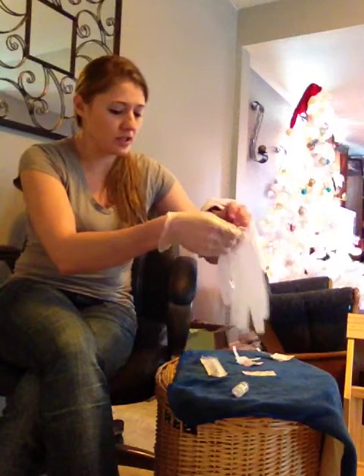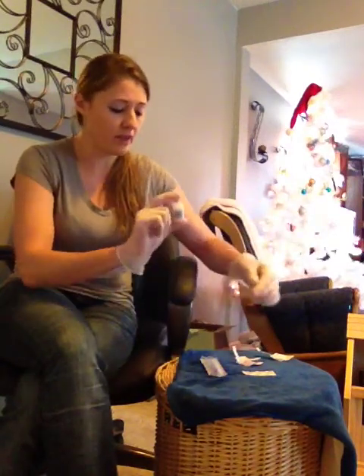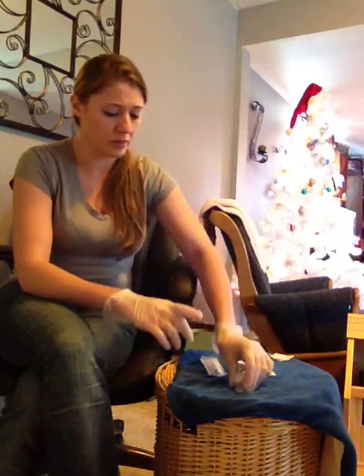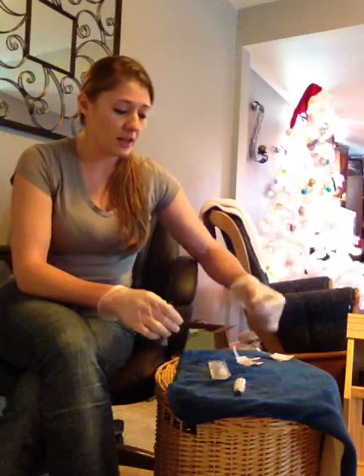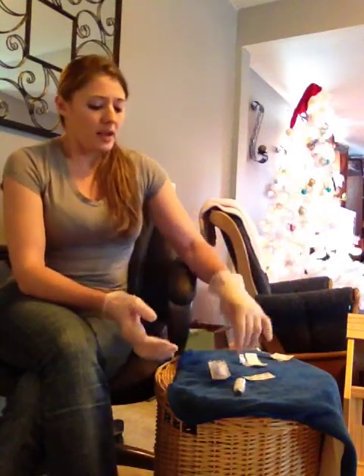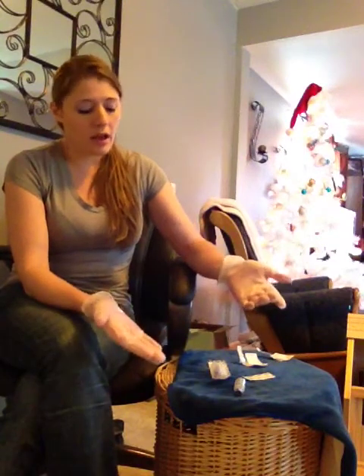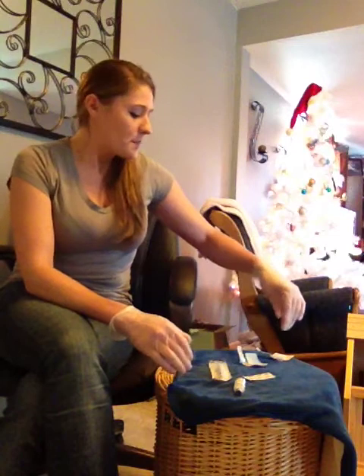For this demonstration, or for an injection, you're going to need a few supplies. You're going to need a vial of solution, whatever your injectable is going to be. You're going to need a 3 mil syringe, which I have here. You're going to need a Band-Aid and a couple of alcohol swabs. And typically you would also need a needle, but for this purpose, I'm not going to use a needle.